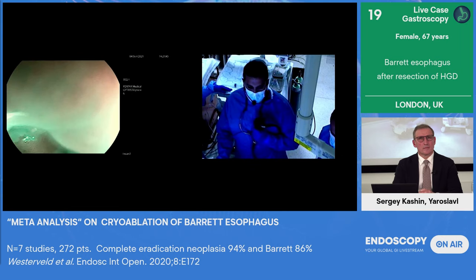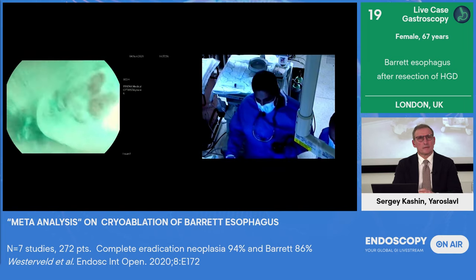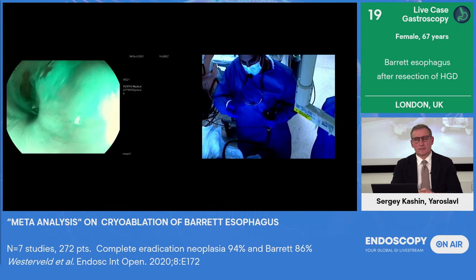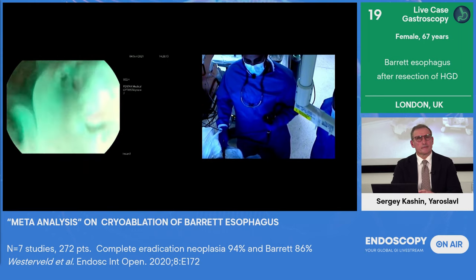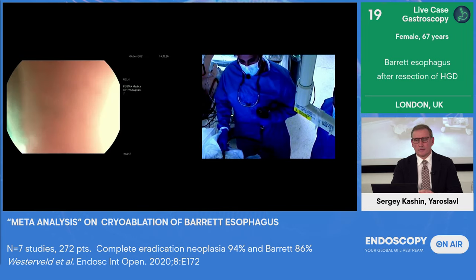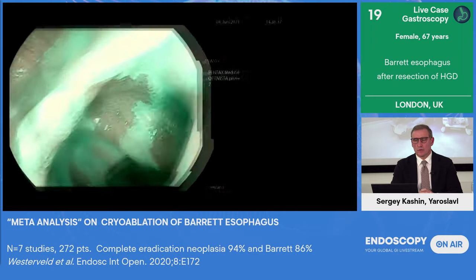She's had a decent response from the index cryo balloon, but it's a very anatomically challenging esophagus. And so one of the advantages of cryo here is that it allows you to use a balloon like the pear-shaped balloon that I'm going to show you, which is, as the name suggests, not a straight balloon, but it has a bigger proximal end and a shorter distal end, almost like a pear upside down. There's also a lot of scarring here. And, you know, this lady is going to struggle if we were using conventional RF ablation with the Barrx system, in terms of getting access to the catheters and also the risk of lacerating the tissue, but also getting good tissue apposition. This area here, you can see with the optical imaging, this is not worrying. This is just a bit of regenerative tissue around the stricture. It's been sampled and it's non-dysplastic.